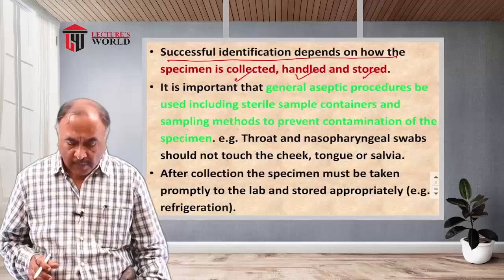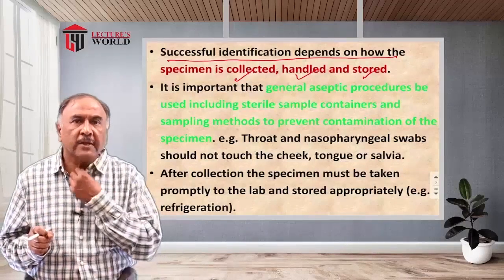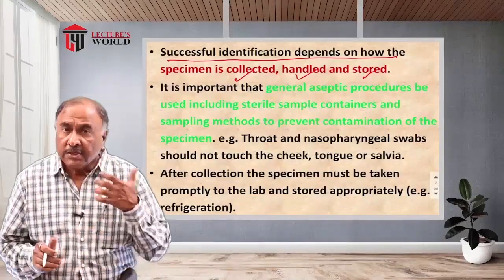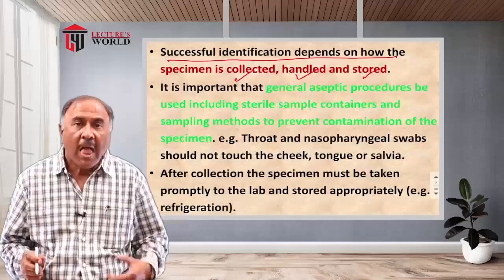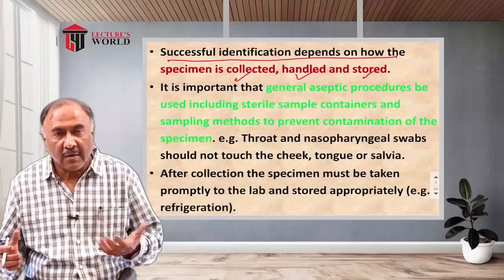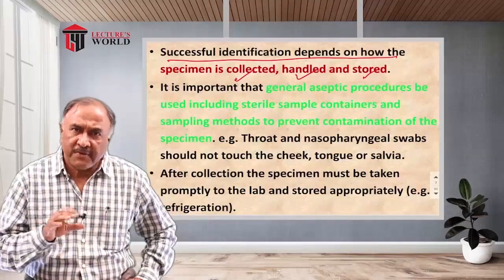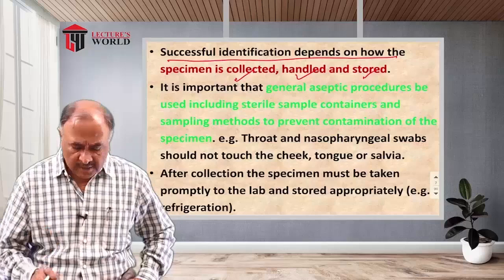For example, throat and nasopharyngeal swabs collected from the throat as well as the nasopharynx should not touch the internal cheek, nor the tongue, nor be contaminated by saliva, because there are innumerable microorganisms present as normal flora of any individual in these areas.